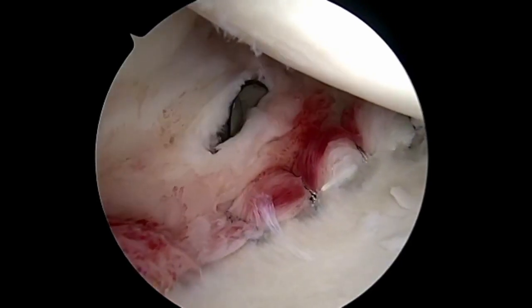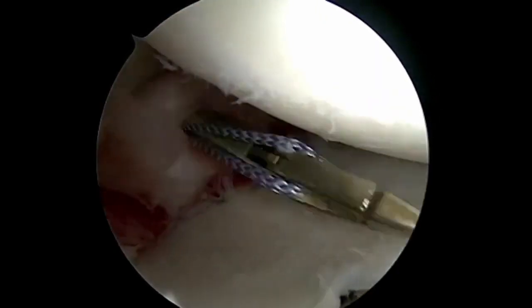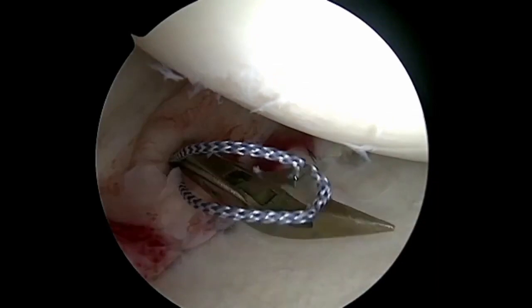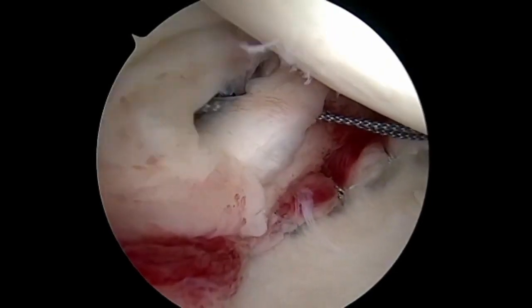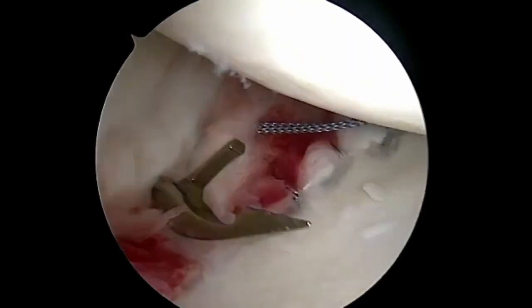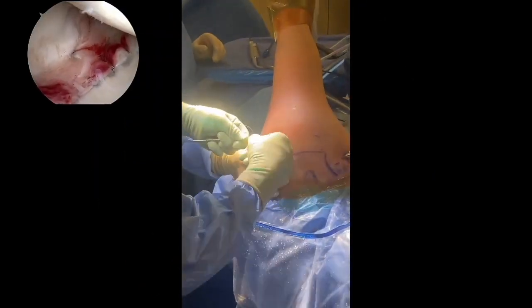We'll unscrew the cannula till it's just outside of the capsule. We'll bring in our suture device loaded with suture and pass it through the capsule inferiorly. We're going to advance the suture as far into the joint as we can, and then try to pull the instrument out without pulling our suture out. We'll then go through the capsule superiorly, grab the loop of suture, and pull it out of our cannula. Now we have both limbs of suture out of the cannula.